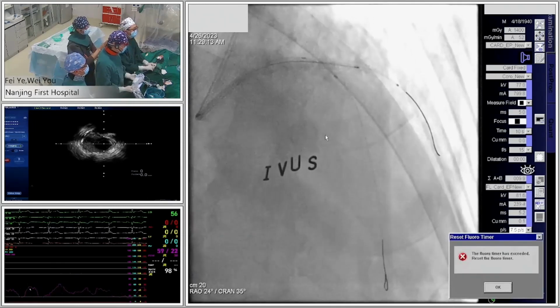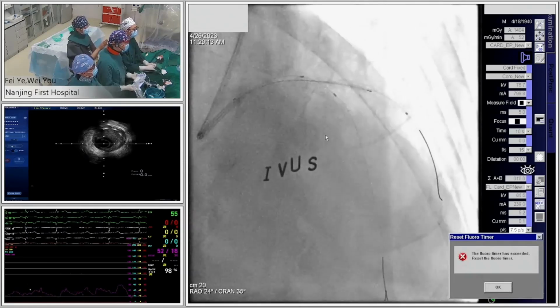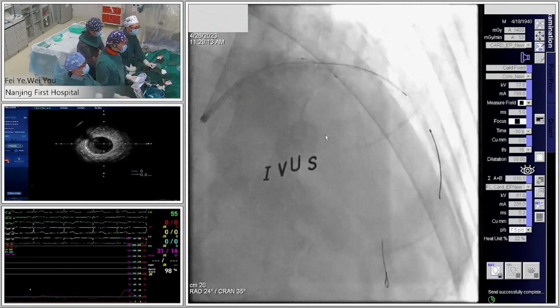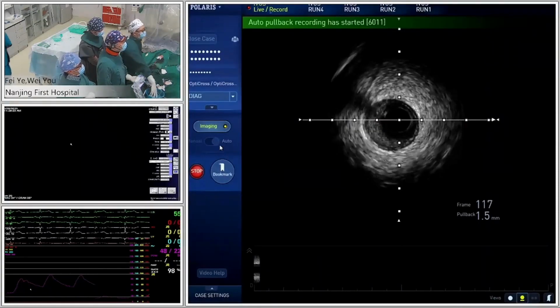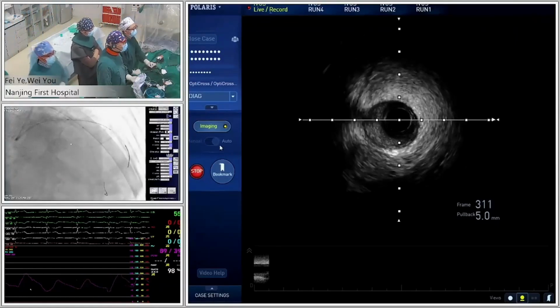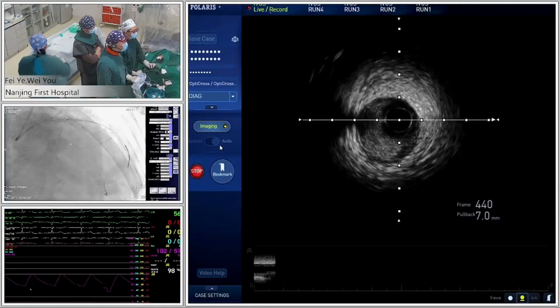Okay, distal. Pull the wire more distal. Okay. How about here? No. I will pull back. Okay, yes. Pull back. Distal vessel is normal. Yes. There is no dissection. A small side branch coming. Yeah. And the vessel is normal. Seems okay. No hematoma.